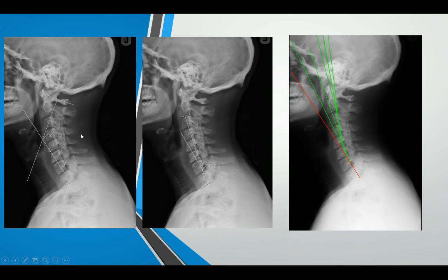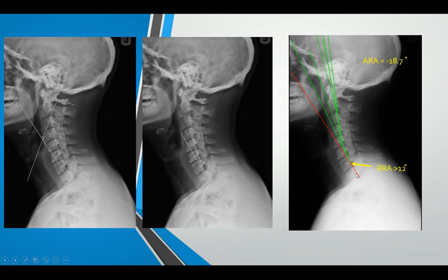Going back to the previous example where the four-line Cobb angle gave 53.4 degrees of lordosis on one measurement and 12.7 degrees on the other — using the posterior tangent method, the red line travelling up the posterior tangent line of T1 shows that when we measure the displacement distance between C7 and T1, we ended up with an ARA of 18.7 degrees total, with the majority — greater than 12 degrees — occurring right between T1 and C7, indicating possible segmental instability. If we use the four-line Cobb angle method, we miss this, and the patient may not have the best outcomes when applying certain types of treatment to the area.